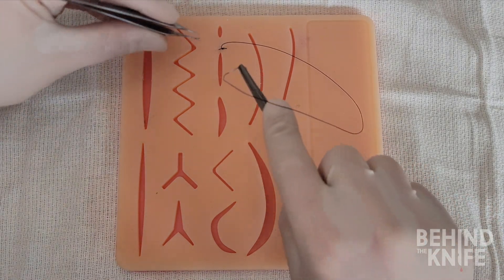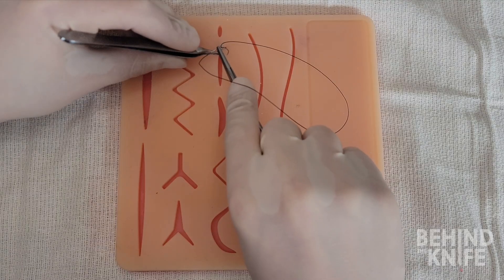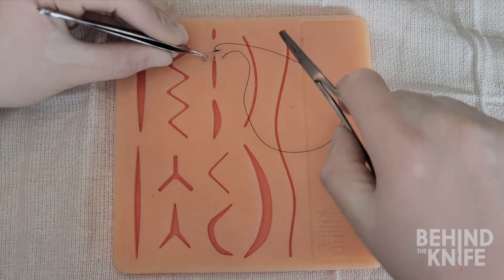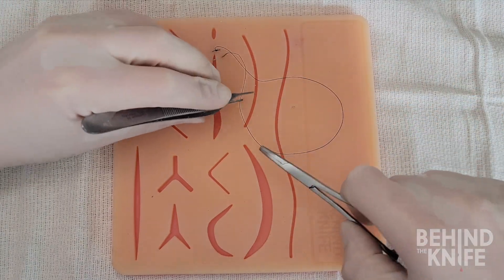You will throw your next stitch the same way. The difference here though is that when you come out with your needle on the other side you will bring your needle driver through the loop you've created prior to re-grasping the needle.